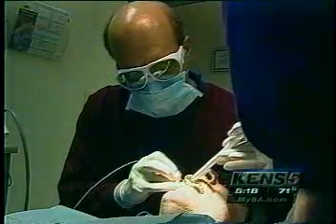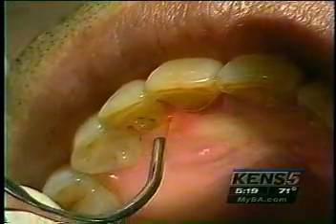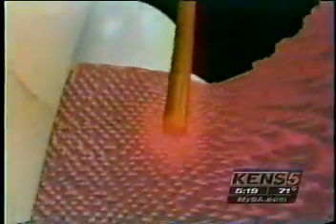It also softens the proteins that hold the tartar onto the root, making it easier for the dentist to scrape it off using hand instruments. A second pass with the laser actually prepares the cleaned-up gum tissue to be resealed against the sterilized tooth, with the fibrin in the blood acting like glue.